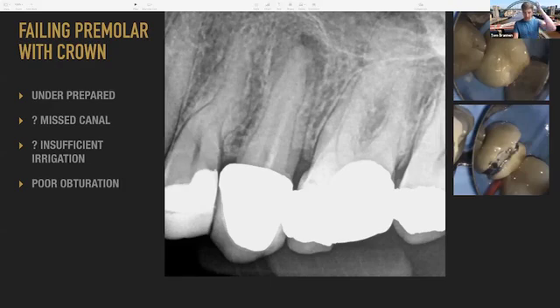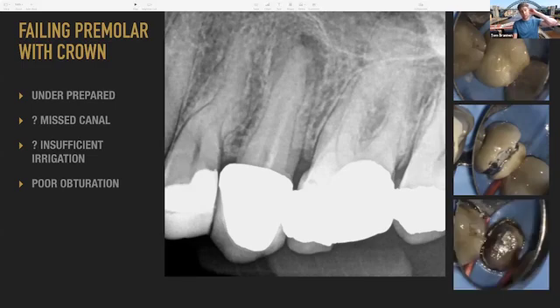Often I'll do multiple teeth isolation, so that I can do the restorative part and then lead straight into the endodontic part. But I know some people favour just single tooth isolation. Again, there's no right or wrong. So, section the crown off, got an amalgam core in there, so a few wedges to help keep things in place.